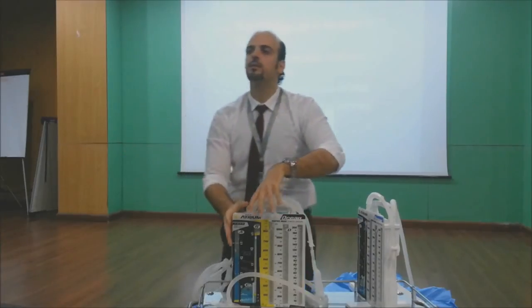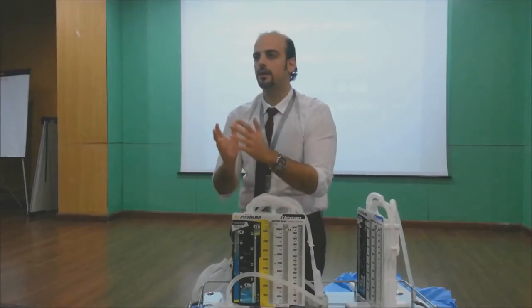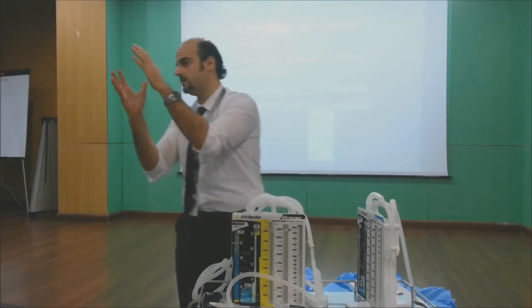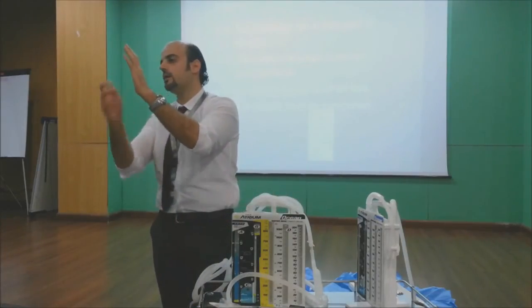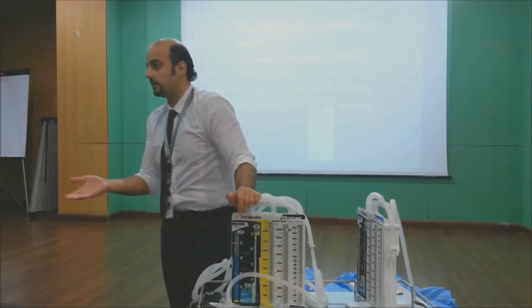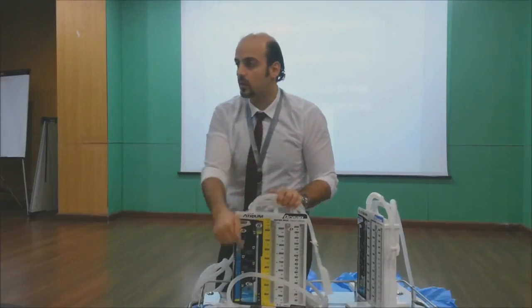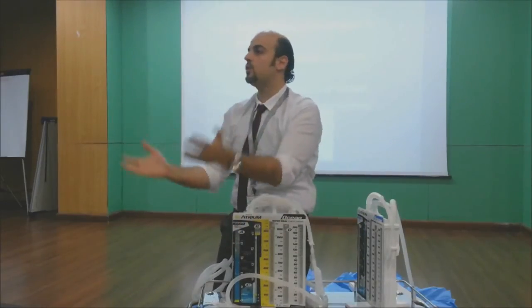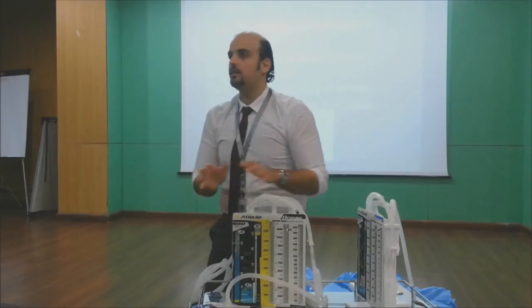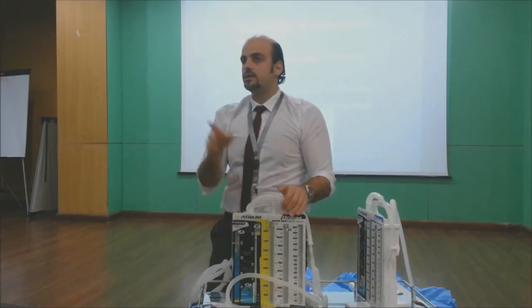All that we are talking about, the diaphragm going up and the chest expanding, is not there. It's only a dead cavity. So the tube is there, draining well, 150 per day, but it's not working as oscillation, because there is fibrosis all around the tube. But it's working as a drain. This is a very good question.